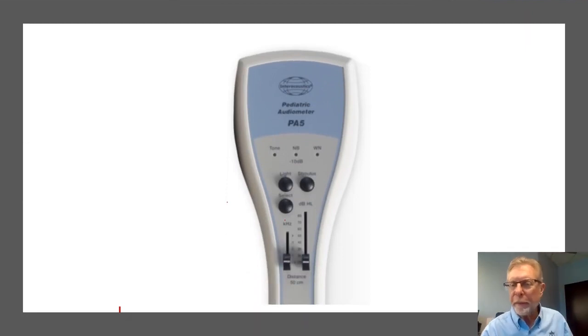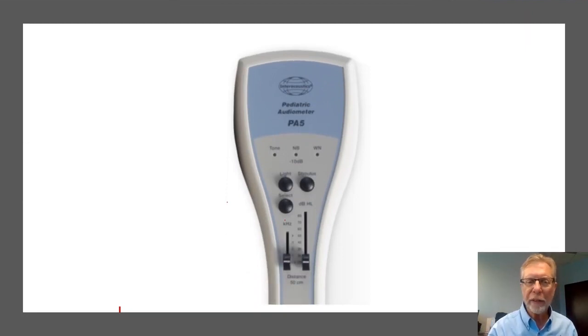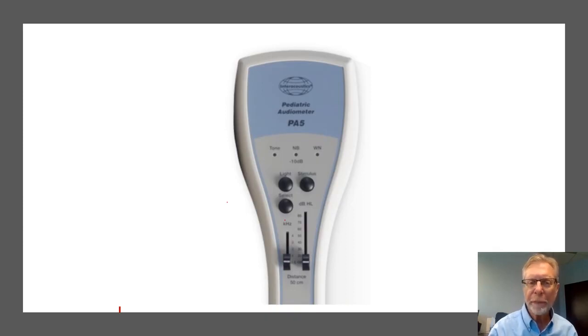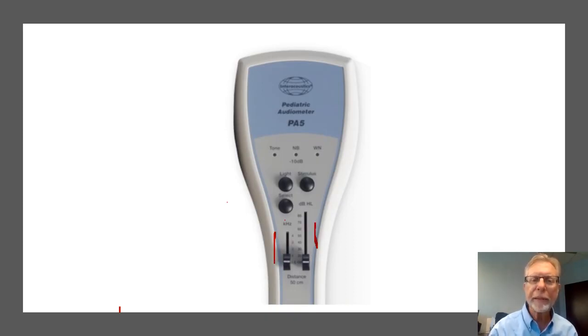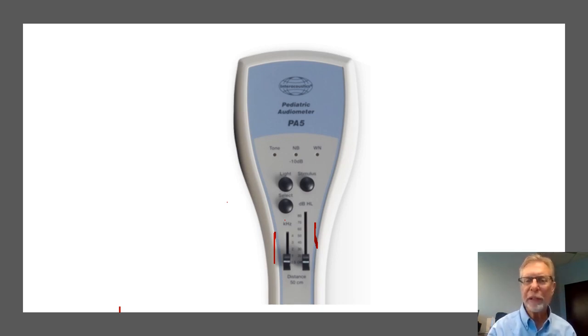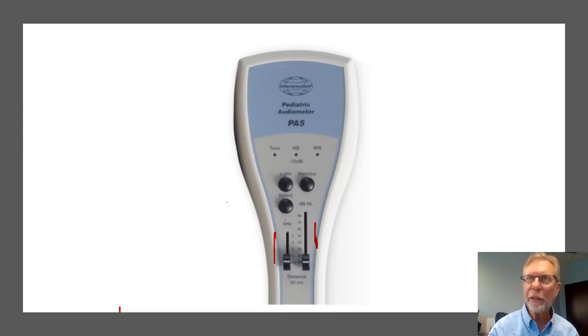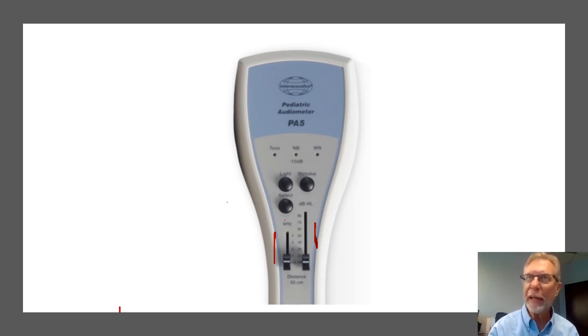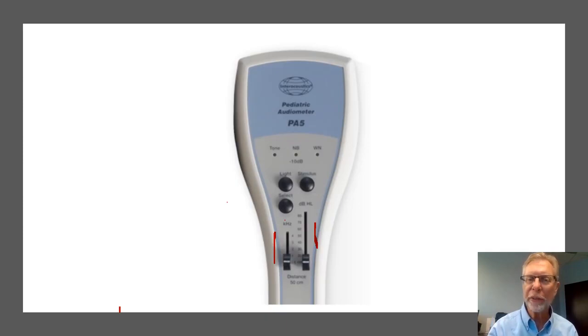Let me explain the control panel for you and go over the five controls that are on there. There are two slide switches. The one on the left is used to control the frequency of the stimulus. That's the pitch of the stimulus. And the four frequencies that we typically test are 500 hertz, 0.5k is 500 hertz, and then 1k, meaning 1,000 hertz, 2k, 2,000 hertz, and 4k, 4,000 hertz. And this is how you would switch in between frequencies.